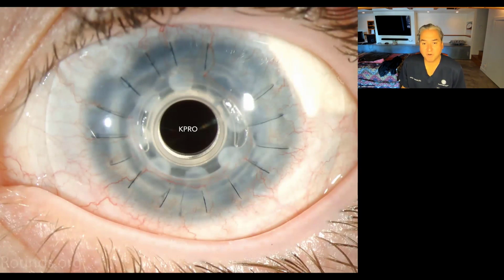So this is a picture of a K-Pro like we talked about in a patient with a vascularized cornea. That's going to be your best choice.